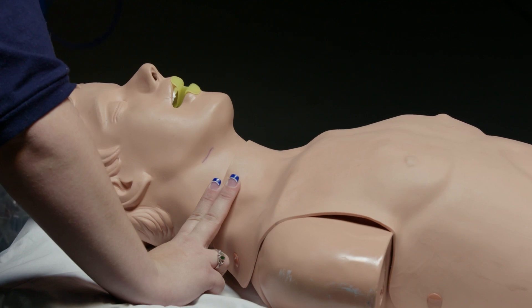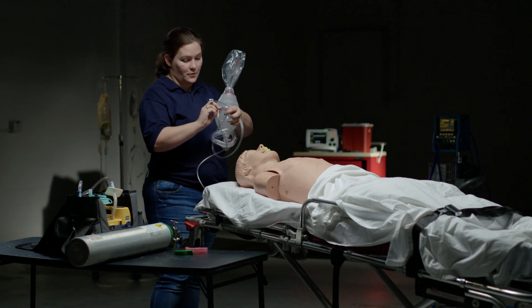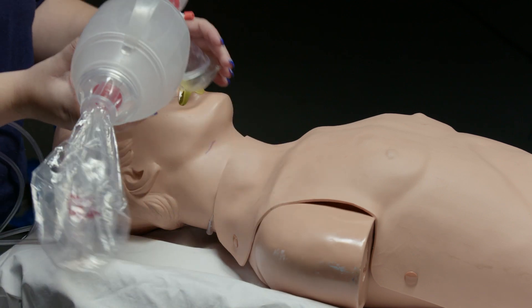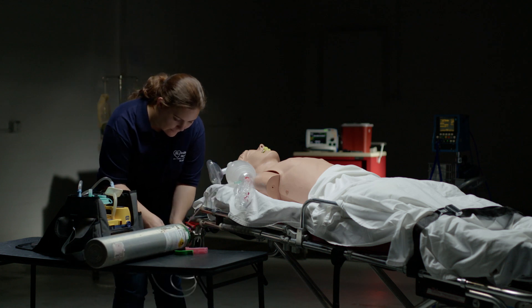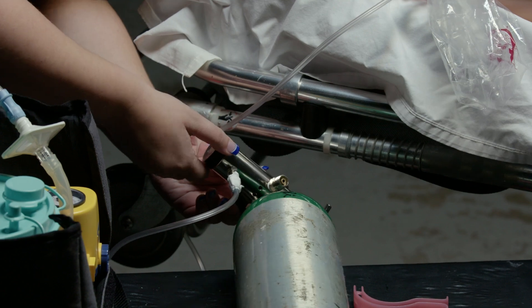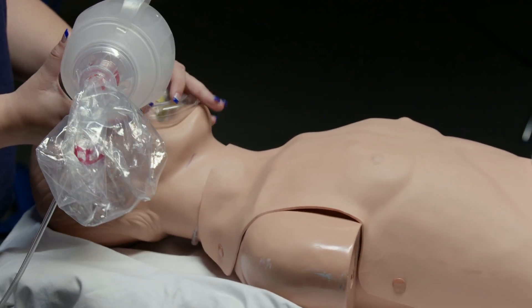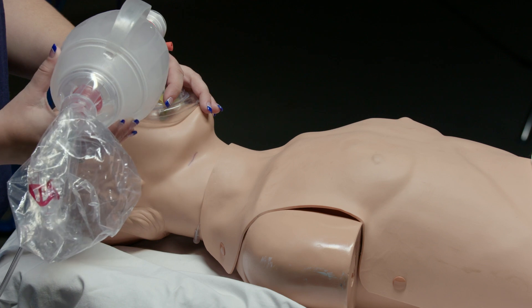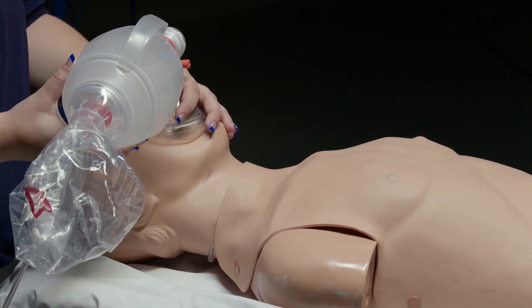There is a pulse. Continuing ventilations at 15 liters per minute, delivering breaths at the appropriate rate with consistent one-one-thousand counts between ventilations.